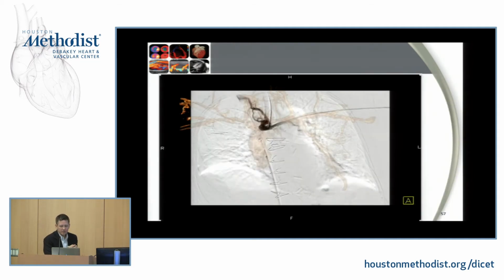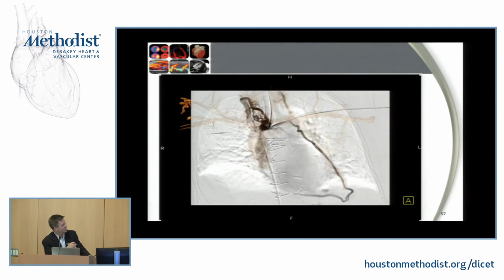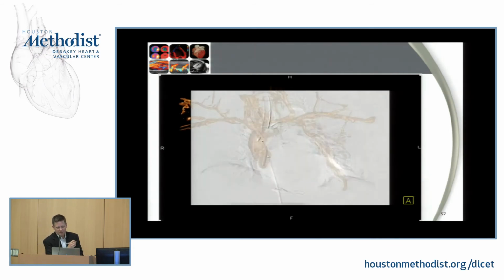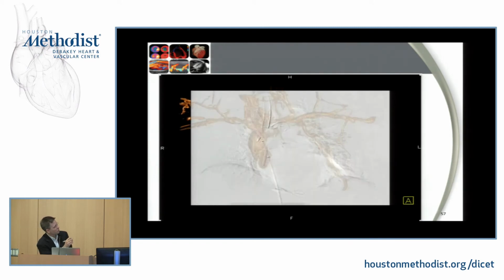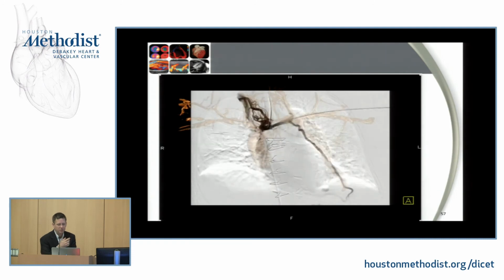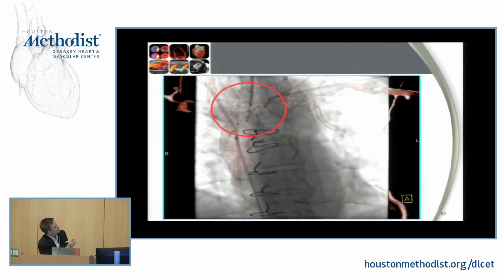Central venous recanalization, something pretty important to us. We take care of lots of dialysis patients, to the disheartening dismay of my patients many times. And the central venous catheters lead to lots of obstructions in these. And here we see this. So this person's gone through and had MR imaging, and then that's been fused into this to try and help with recanalization and trying to reopen these veins, because this is one of the real problems for these folks, is that once they're out of upper extremity access, they wind up with things down their legs, which is not so ideal.